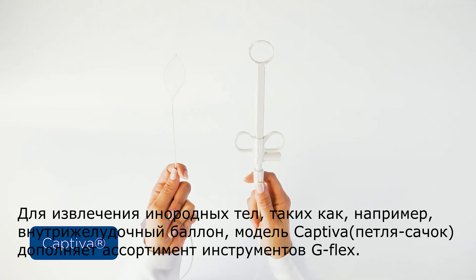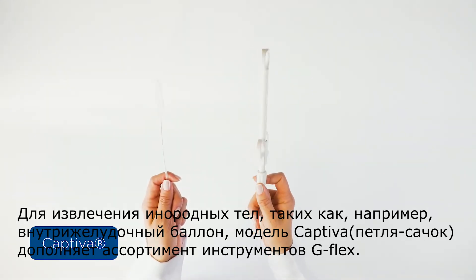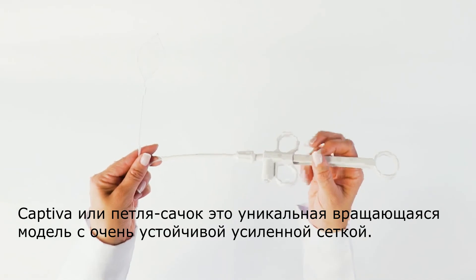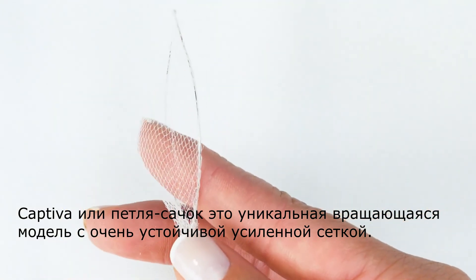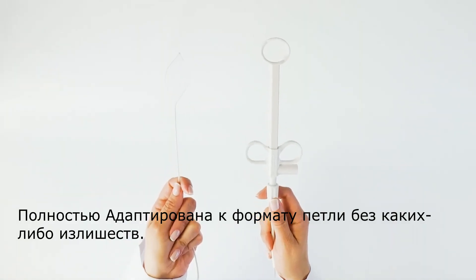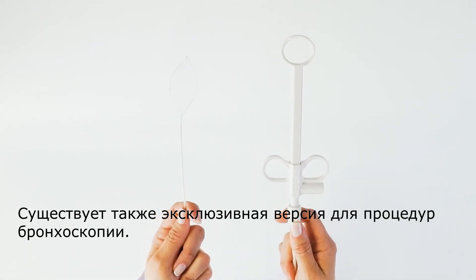The Captiva model completes the foreign body retrievers portfolio offered by G Flex. It is available for both adult and pediatric patients. The Captiva is a net snare device with a unique smooth rotatable feature. The net is delivered with an extremely resistant network, completely adjusted to the snare format with no excess. There is also an exclusive version for bronchoscopy procedures.